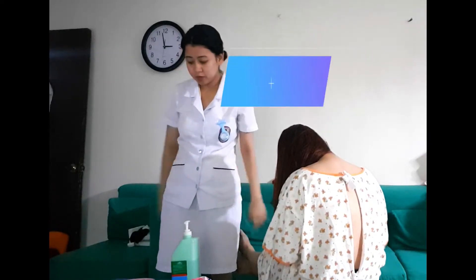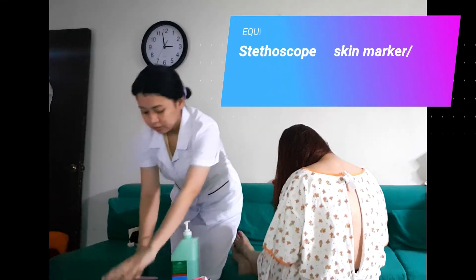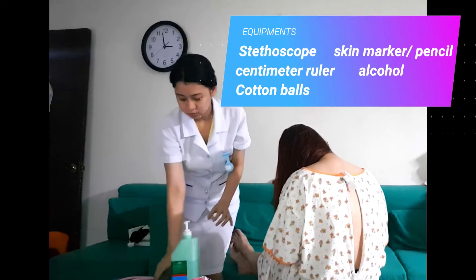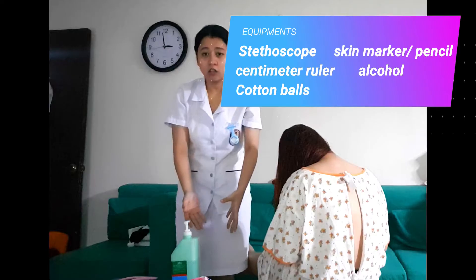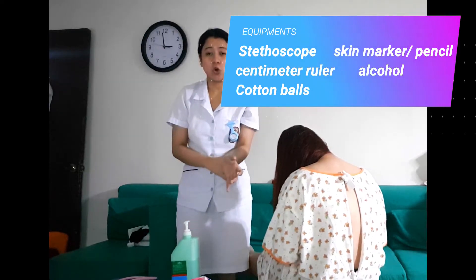I'll be presenting the posterior part only to protect the client's privacy. First, I'd like to introduce the equipment I have with me: the stethoscope, the skin marker, pencil, the centimeter ruler, and I also have alcohol and cotton balls to clean the stethoscope.